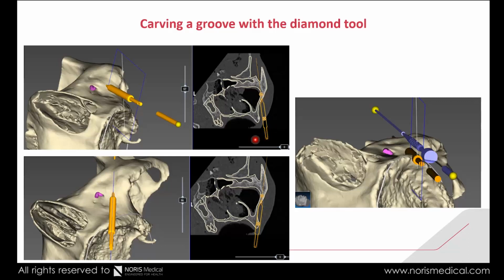We move it down this way until it comes to the bone here, and actually remove this bone. Basically what we've done now, we have this angle and we have this line here that will show us how much we went down. Because if you can see, the continuing of this line is actually the line that we want to be. But we have to know if we are in the right position. This is how it looks in 3D.